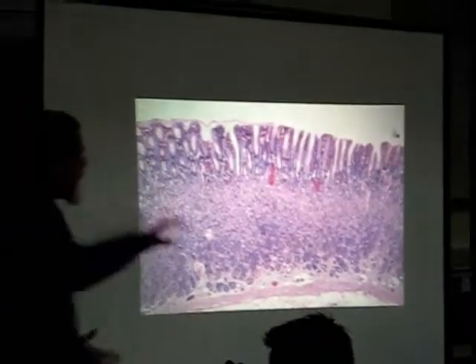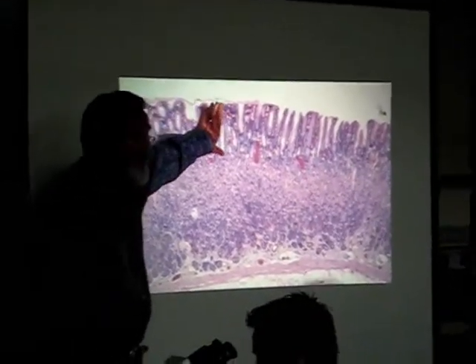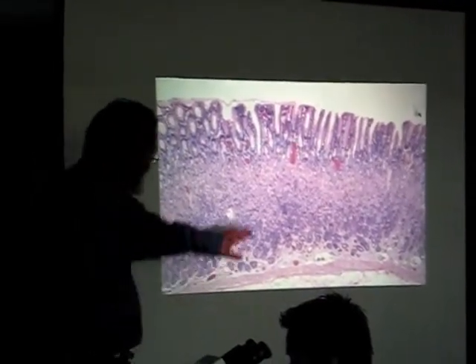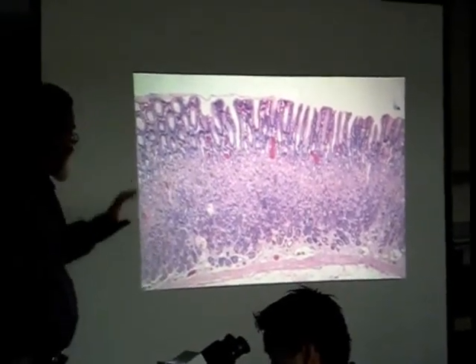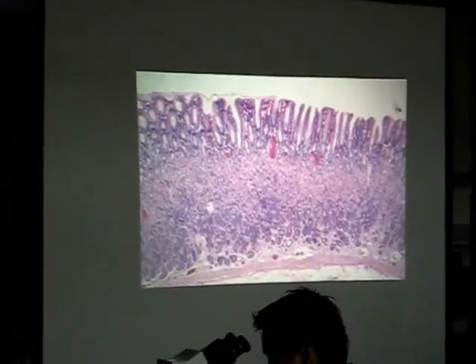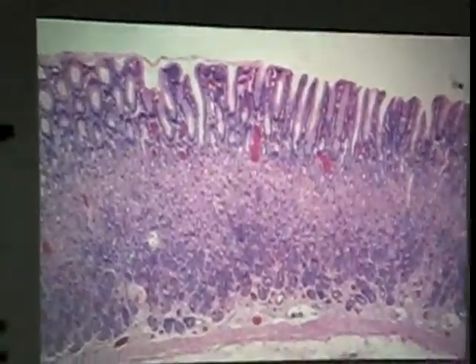Okay? It's a little bit difficult in this section because you've got a gastric pit or a duct. The gland is a tubular gland that's coiled every which way. So you have all these circular profiles. All right? I'm going to show you a micrograph that will help make that clear. What I want to point out here is something that helps you identify the mucosa from either the fundic or body regions of the stomach.